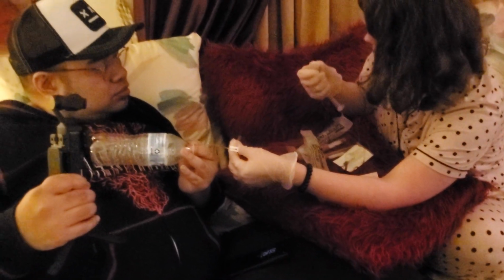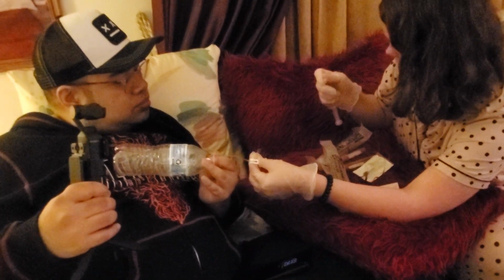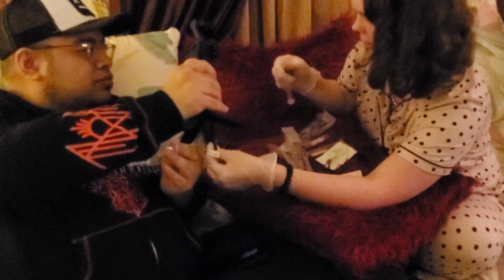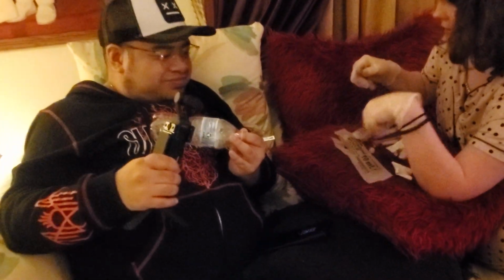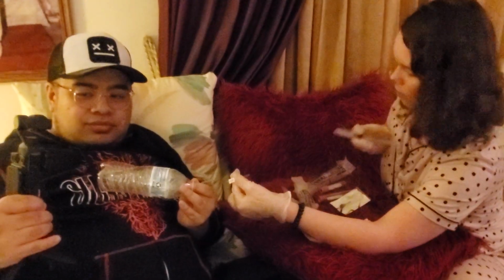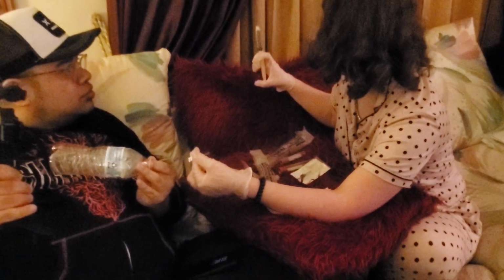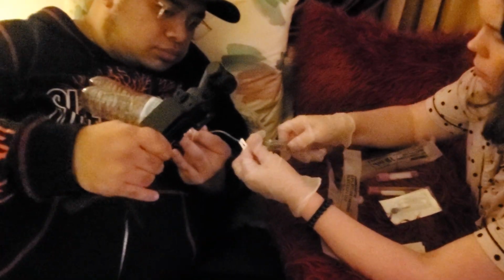Why is it so hard? Am I turning it the wrong way? I'm turning it both ways and it's not working. Alright, hold on. Pretend I didn't drop this. Don't do this. Alright, that never happened. So, I took the cap off. I'm checking there's no air bubbles by squirting some or wasting some. And it goes. Open.